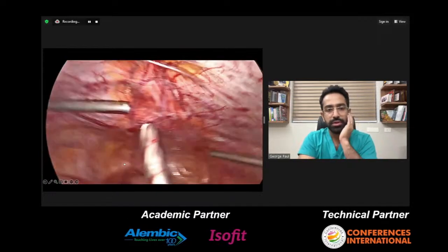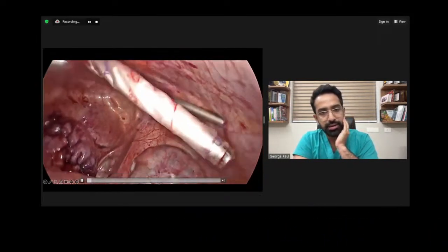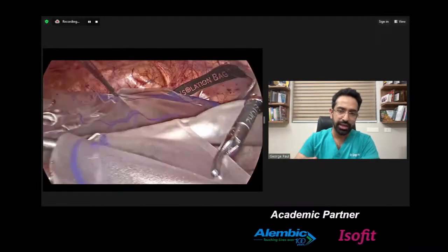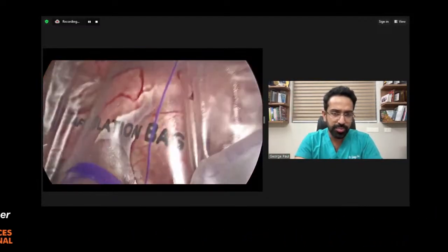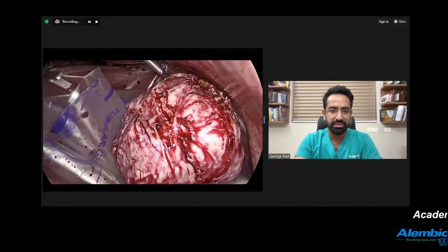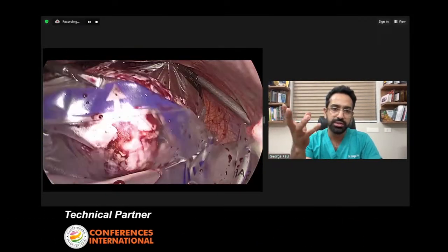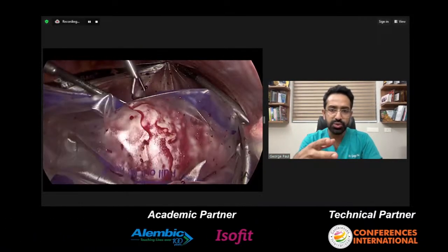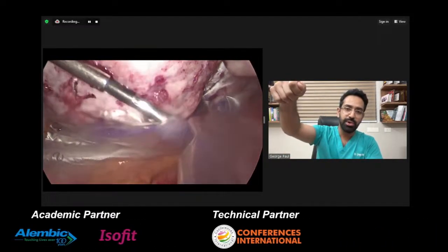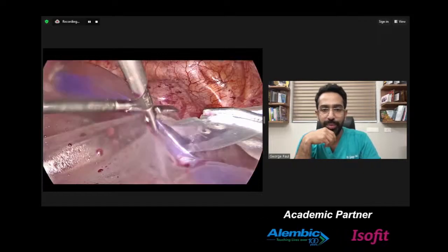Once the bag is inside, you hold on to the eyepiece and unroll the entire bag. This was a case with multiple large myomas. I had already done the myomectomy and everything, so I'm just showing you how it is introduced into the bag. With very large ones, you may have to use a tenaculum or myoma screw to hold on to the myoma and bring it into the bag.